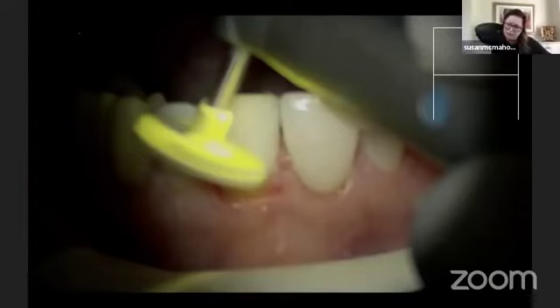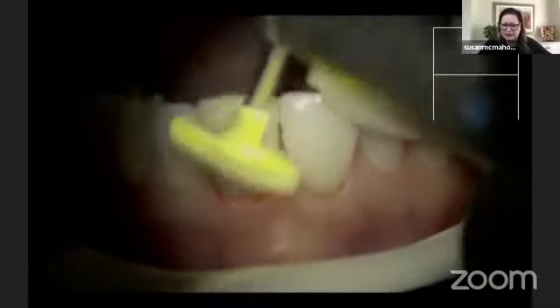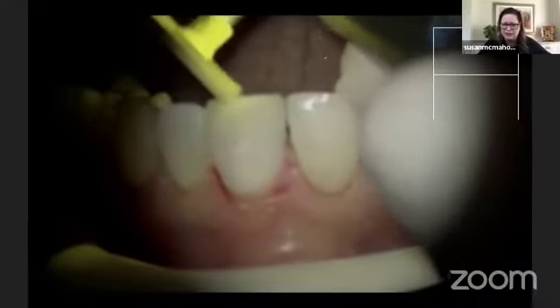I'm going to take the medium spiral finisher first, and very lightly go over the surface of this composite with it. If I wanted to reduce the lobes or the striations, make that surface texture look less rugged and less deep, I would go over with this medium polisher a few more times. This is how we decide how deep or not deep we want that enamel surface texture to be. But basically it is just a few passes. You see it's starting to shine up, and that's it. A few passes and then across the incisal edge.